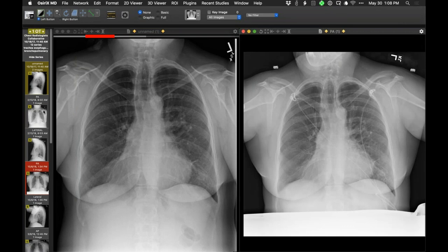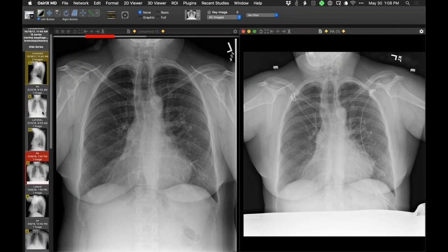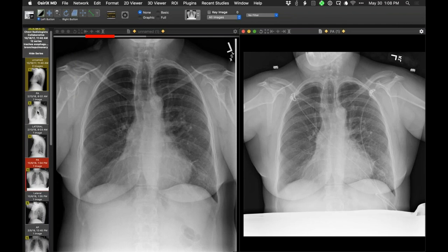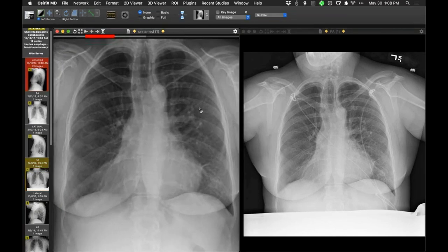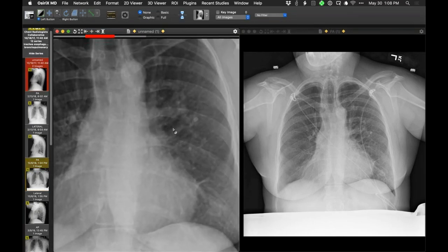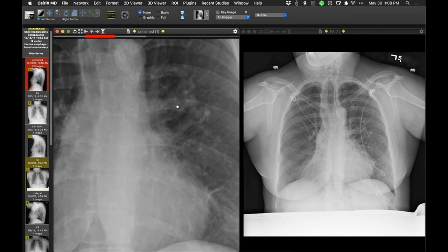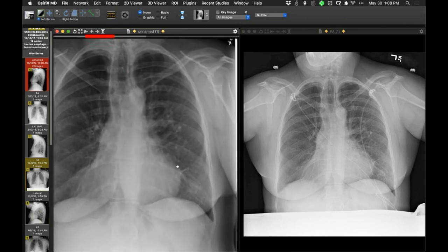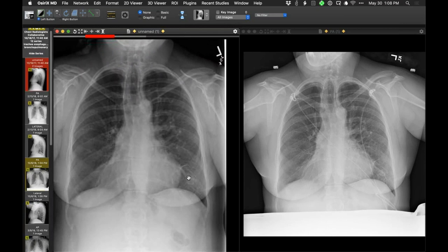She's got a lot going on, it looks like. A lot of potential things. Is her esophagus dilated, just like a presbyesophagus? Very good. And then there's that left hilum, just lateral to it - there's like a tubular thing there. I don't think that's going to pan out to be anything particularly abnormal. But the esophagus, interestingly, is dilated with air, certainly here, on all three exams.